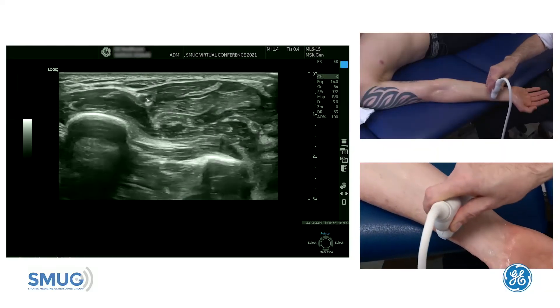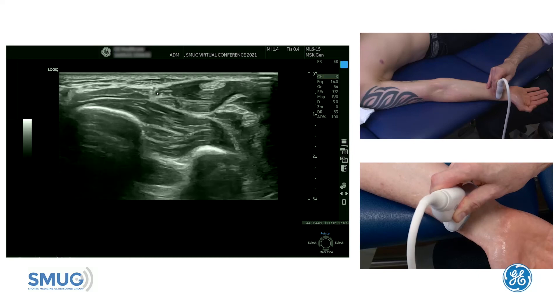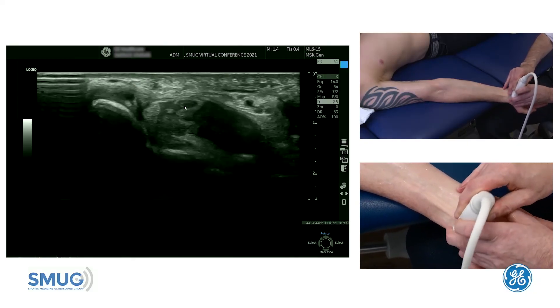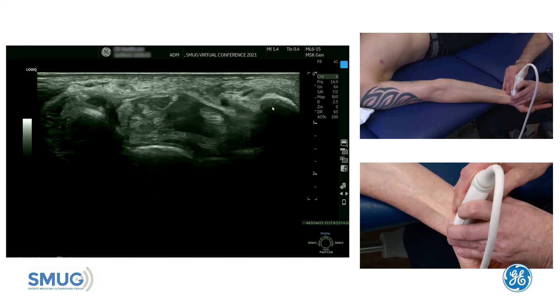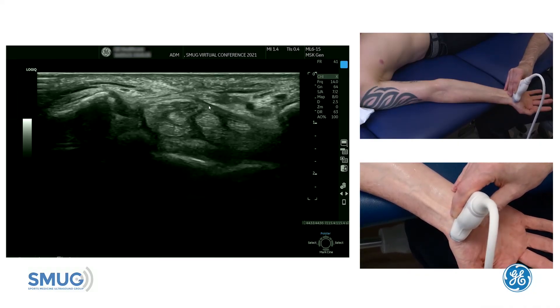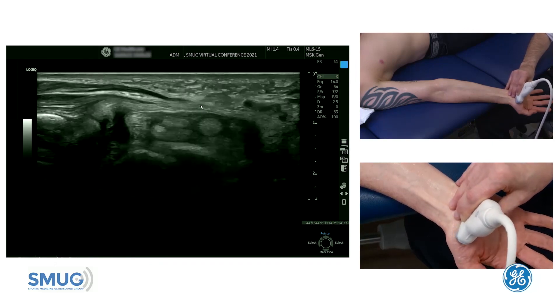Now we're getting close to the wrist and you can see the nerve moving up superficially. Deep to that is the pronator quadratus. The nerve works its way into the carpal tunnel — if we move it a little higher, we want to make sure that at that point we have both bony landmarks: the scaphoid on one side and the ulnar side there. That's Guyon's canal there — there's your nerve under the transverse ligament, quite visible. Angle it, work it, make sure you have a good view on that as well as the ligament on top and all the surrounding structures.